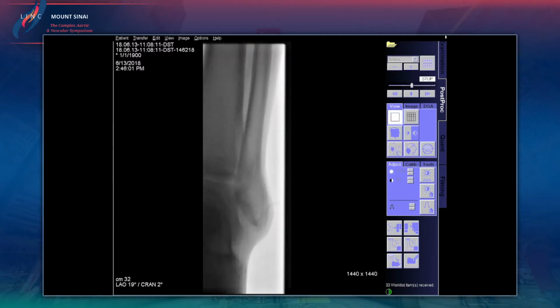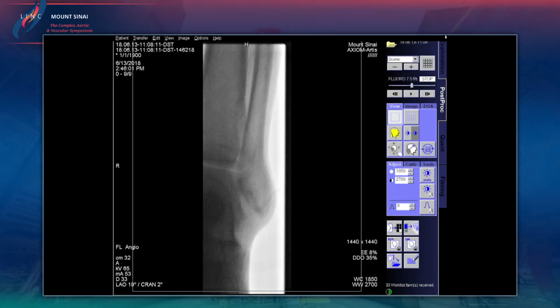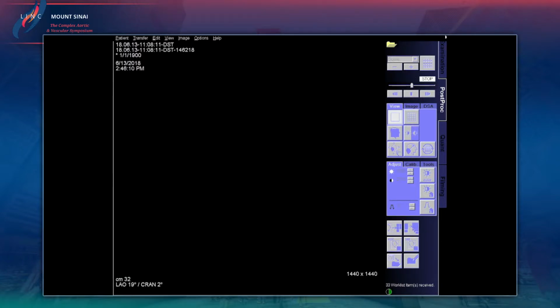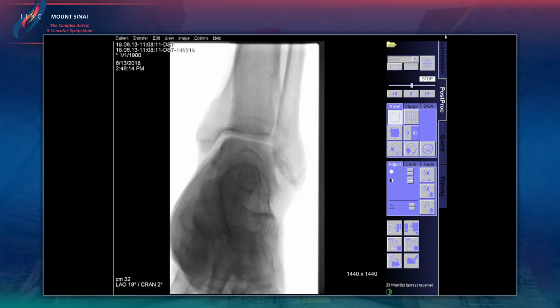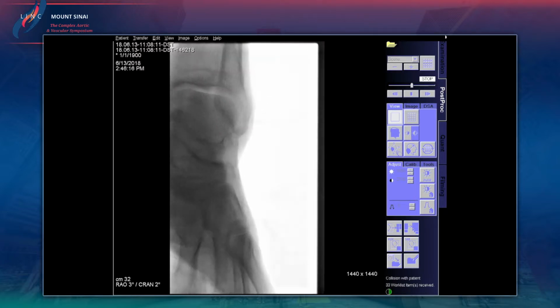Can I have a little more dye, please, in this syringe? And I think for the audience, this type of selective injection also helps. Let me see whether we can see the forefoot. Forefoot and a lateral view if possible. Yeah, that's what I'm going to do now. I know I'm being needy. No, I do the same thing.